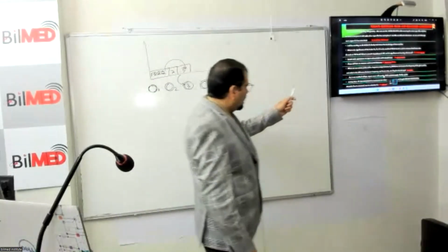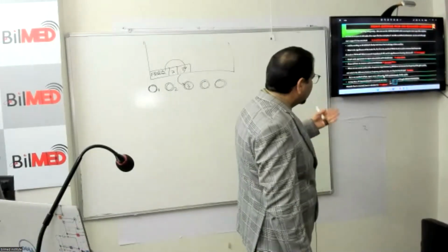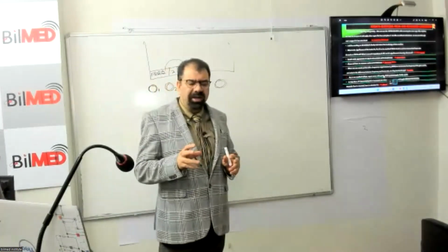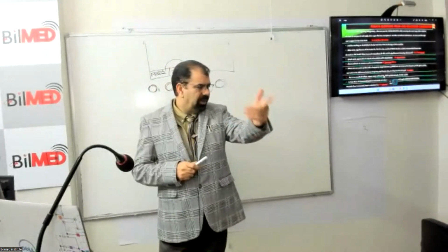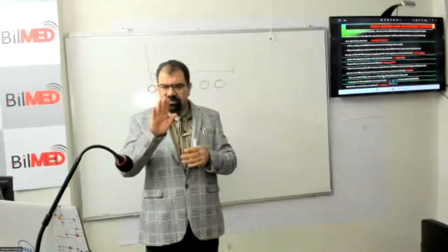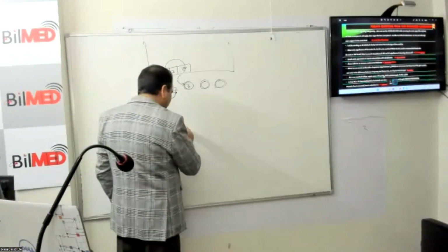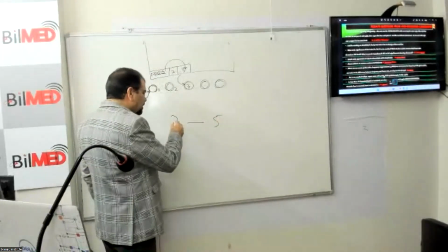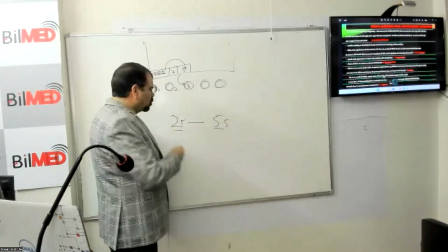Now, I'm just elaborating the answer. How to increase the frequency of the given probe. Now, in a probe, Anna, give me the probe. In a given probe, in the next room, maybe. Now, in a convex probe, there is a bandwidth frequency, and the bandwidth frequency can be between 2 to 5. I'm using the words can be. It can be maybe 2.5 to 5.5. So it is roughly between 2 to 5.